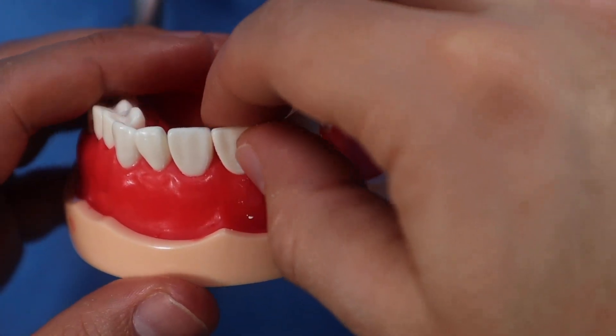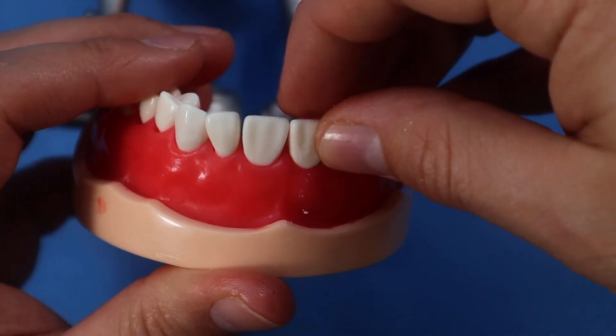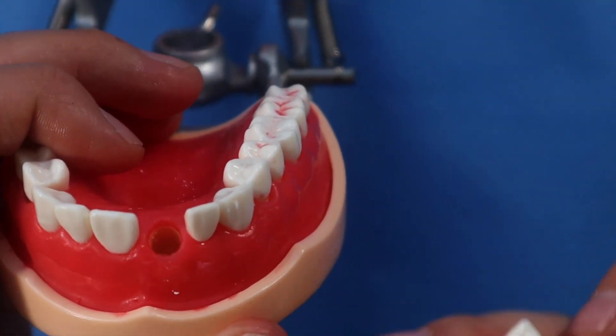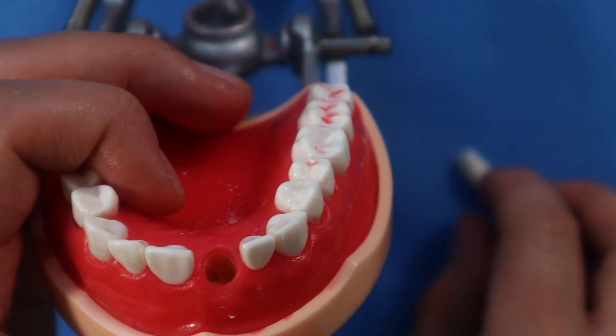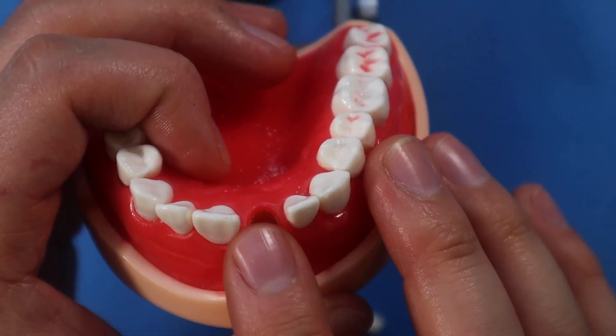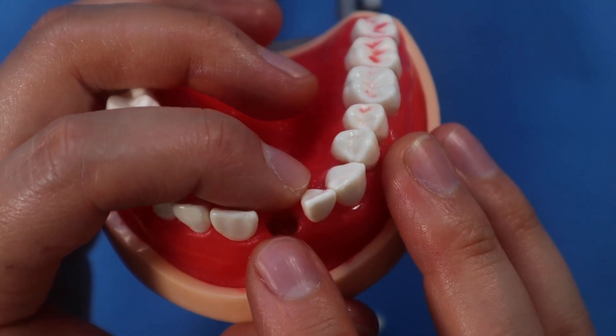This tooth is ready to come out — best atraumatic extraction you'll ever see. The tooth is out and now you have an extraction socket. I'm not showing you how to place your implant — you'll place your implant in here. I'm going to show you how to temporize that tooth.